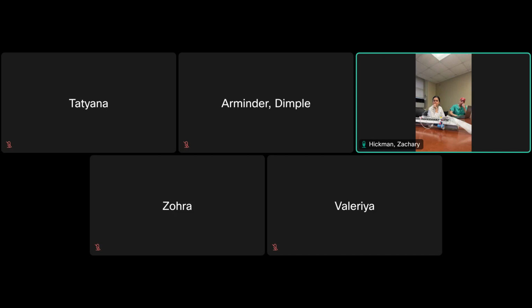You aim a little bit toward the nasion, and for that one, you just don't want to go inferior. It's pretty horizontal. It's pretty much in the horizontal plane in terms of up and down, or maybe even a little bit up sometimes. And you want that one, it's usually around 10, definitely no more than 10, so 9 or 10. But you pop into the ventricle at like 5. It's a lot of soft tissue that's pulsing.